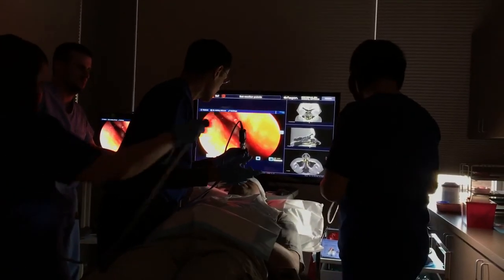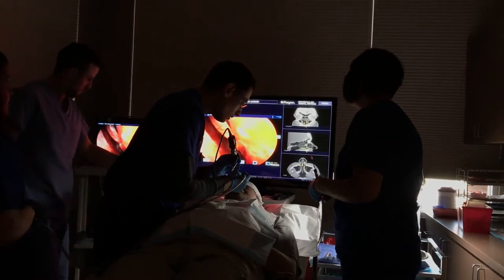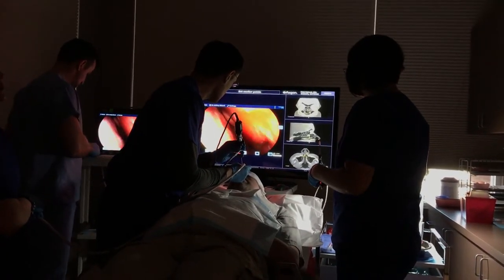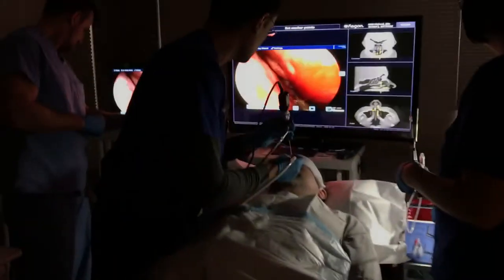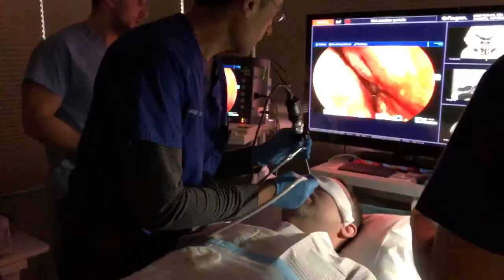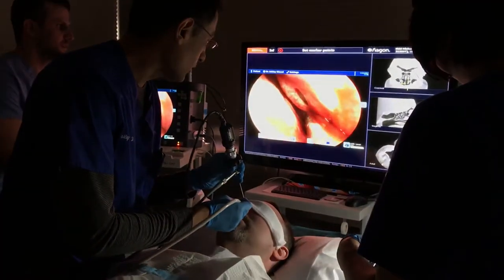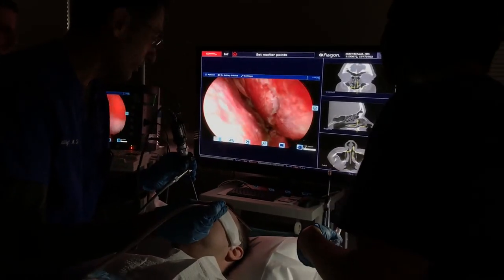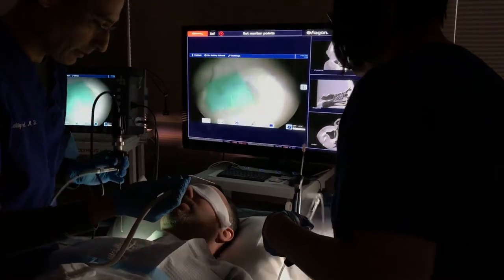That was your sphenoid sinus. Okay. Which is at the back — it's the back wall, way at the back. A chip that came out of that. So now we'll do this side.